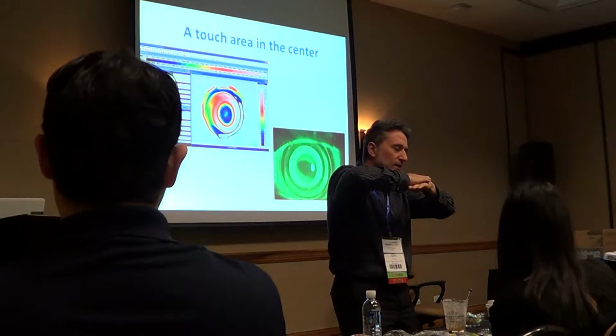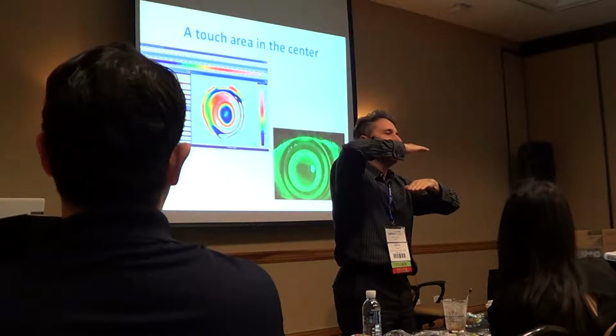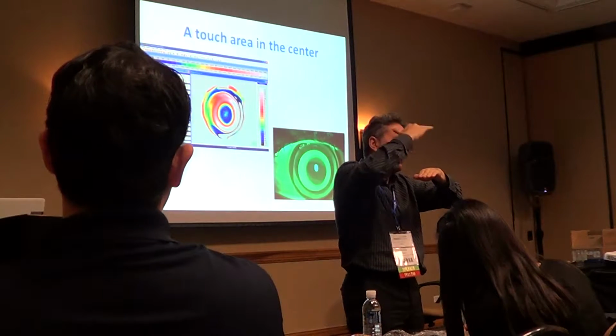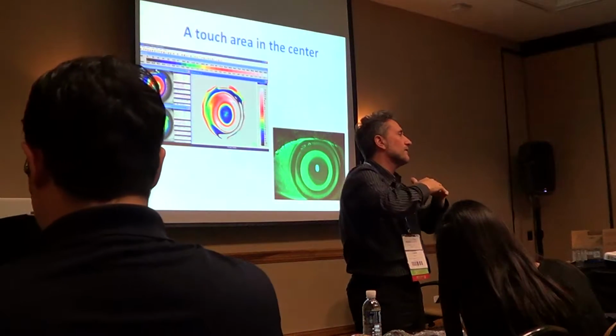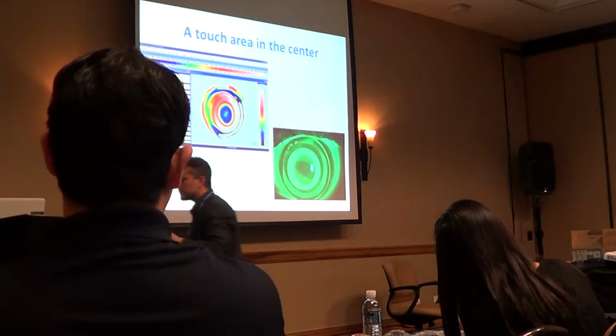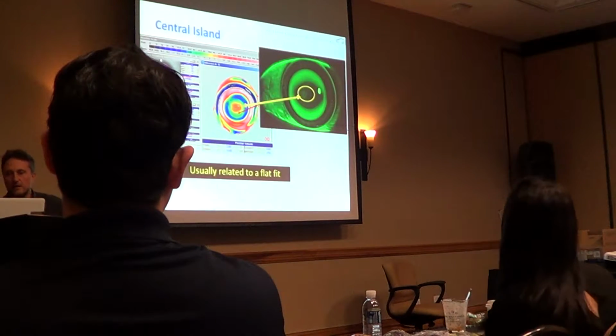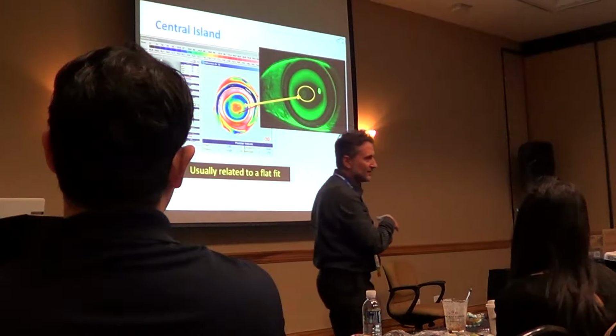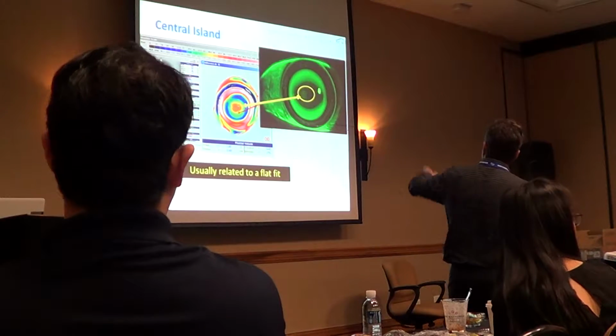you should increase the sagittal height of the lens to create some space between the back optical zone of the lens and the cornea, around 5–10 microns is enough. But we need to do that. That's Central Island. That's real. That's a real case. On that last one.